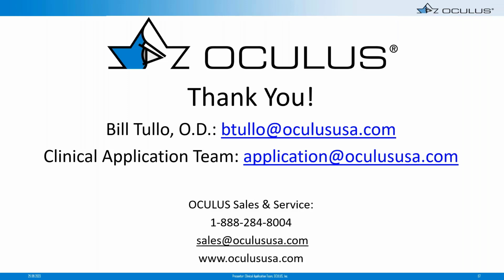So I'm going to ask Carver, do we have any questions tonight? It sounds like Carver may be having some technical issues at this moment. I'll go ahead and ask the first question. I often see patients with dry eyes and they end up with fixation errors. Is there a solution for this?